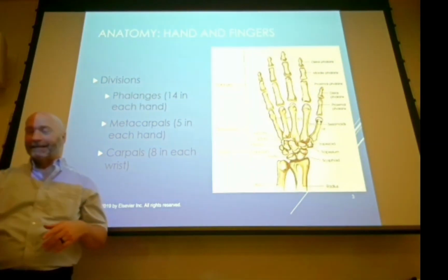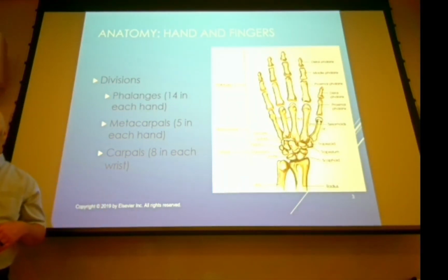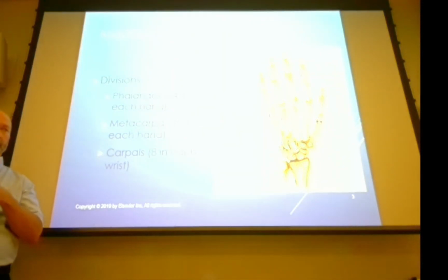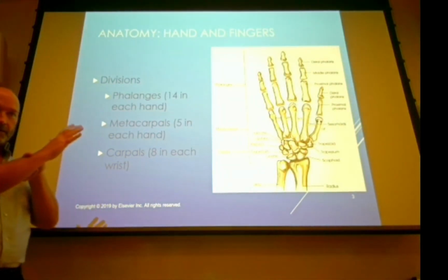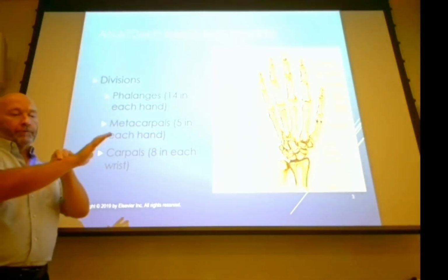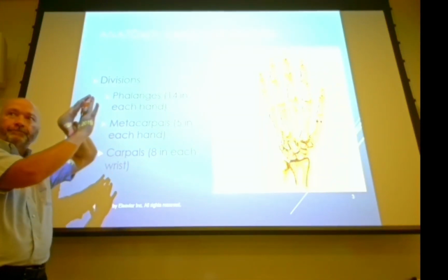And this gets a little bit complicated, but the function of your hand just doesn't work well without the wrist bones. So we're going to include the wrist bones all the way up to the distal portion of the radius and the ulna. Okay. So from here to here is what we're going to include for a hand x-ray.